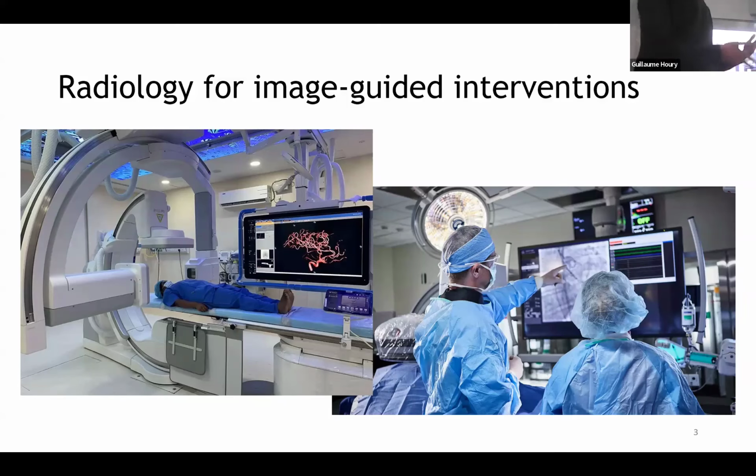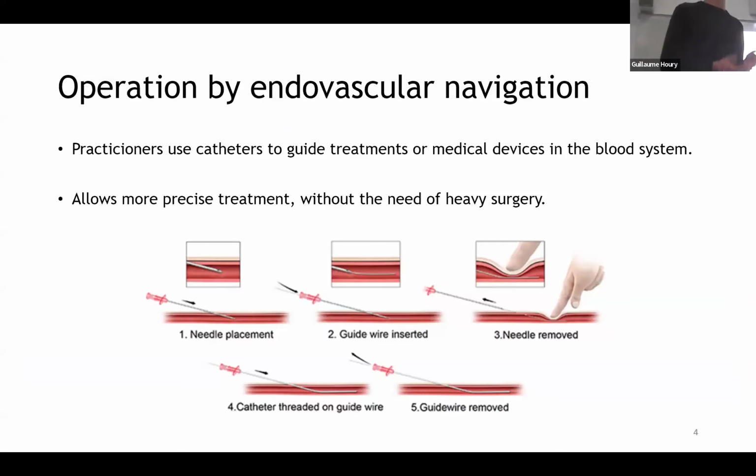This kind of image-guided intervention can take multiple shapes, but a very common kind of operation consists in navigating in the blood vessels of the patient.